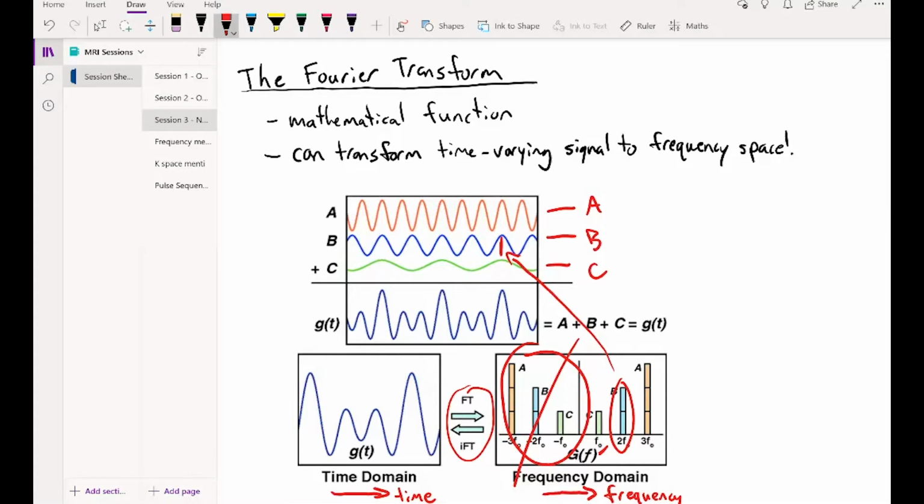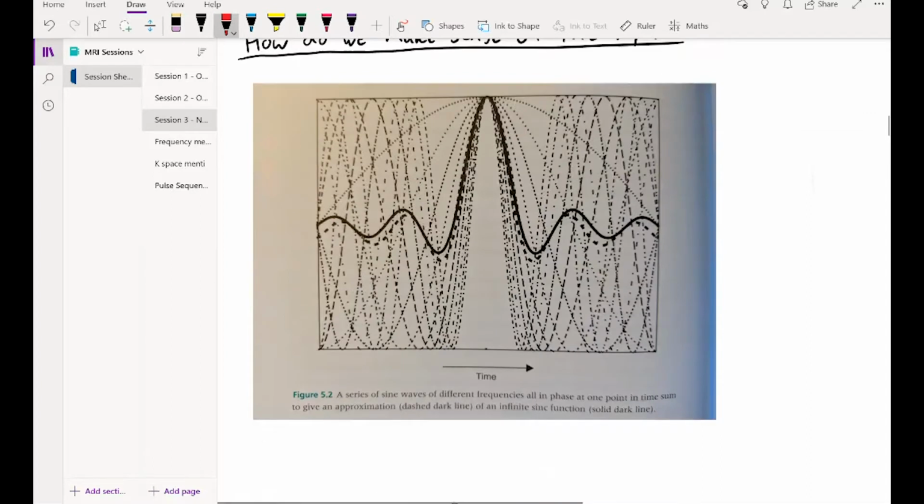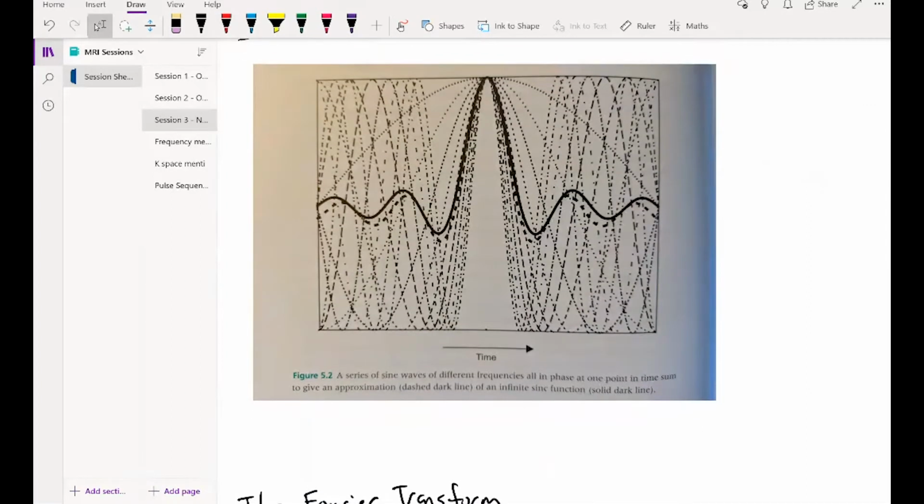And that is essentially what we need to understand about frequency space, basically how it's representing subsignals in our image. Hopefully you can see how this might be useful when we are trying to break down that bolded sinc function that I had above into its component signals.